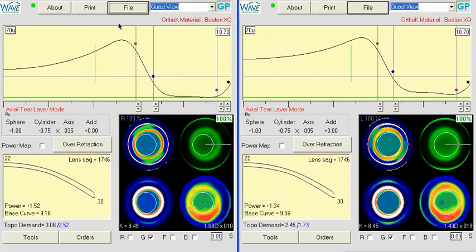So given that, if the patient is interested in proceeding, it looks like we need a little bit more of a gradient under the lens. Right now, the tear film under the lens is a little bit thicker here, but overall it's kind of uniform across. And if we really want to mold epithelium, I think we need more of a gradient. We need less clearance centrally, probably maintaining the same clearance at the peak of the return zone.